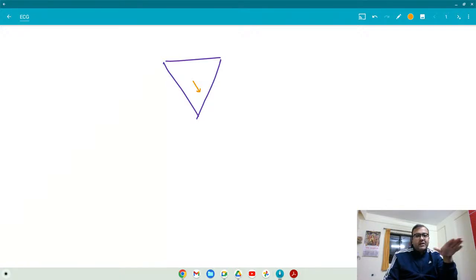So first let's talk about atrial depolarization from here. You are going to tell me atrial depolarization from lead 1, if you think about that. So what are you expecting?